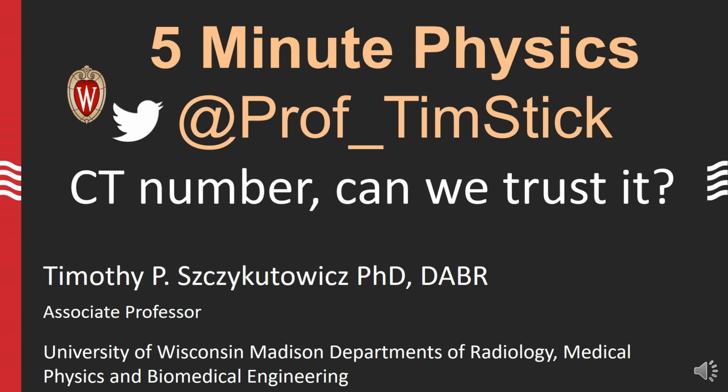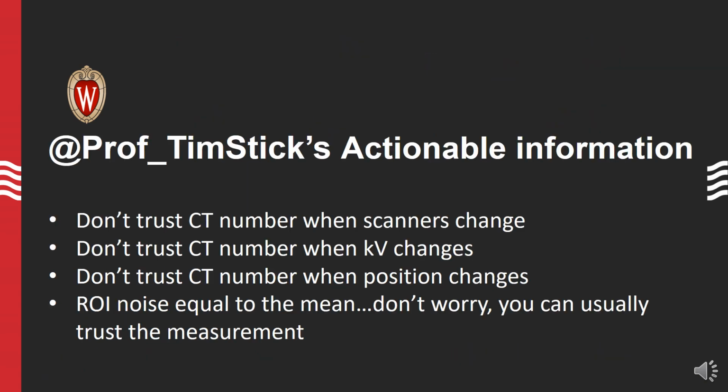This is 5-Minute Physics, and today we'll be talking about CT number. Can we trust it? By the end of the talk, I hope that you guys can learn this actionable information. Do not trust CT number when scanners change. Do not trust CT number when KV changes. Don't trust CT number when patient position changes. But if the ROI noise is equal to the mean, don't worry. You can usually trust that measurement.